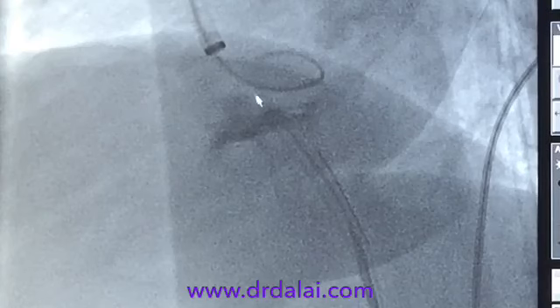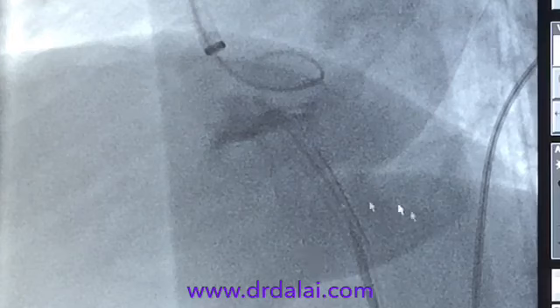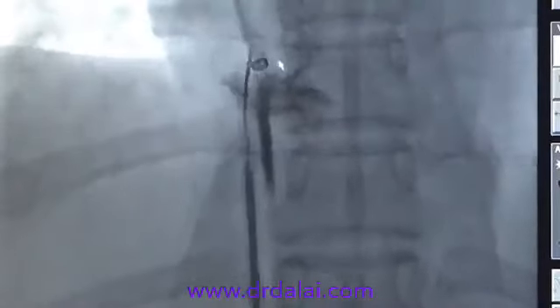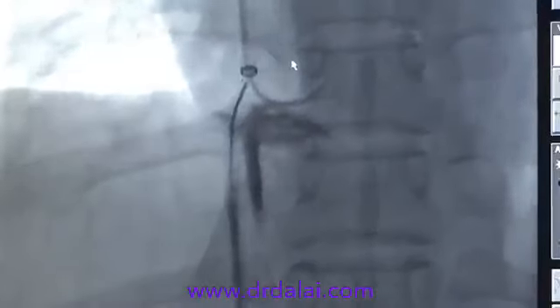And interestingly, our sheath is also over here, and because the IVC is very posteriorly placed in the infrahepatic segment, once you are coming here, you try to go a little anterior and try to go inside the sheath with your Chiba. I will show you how to do that. This is our Chiba, and you're very safely placed and going very smoothly. Get to the lateral view. You have not punctured, you're still in the occluded segment, trying to get inside the sheath, but very gently, hardly pushing, millimeter by millimeter.